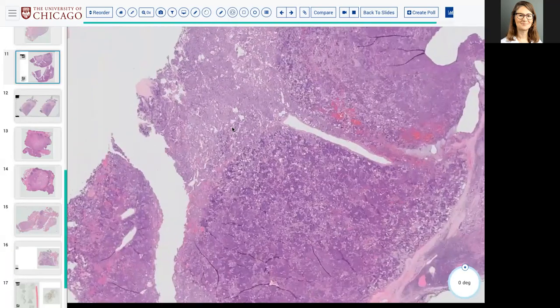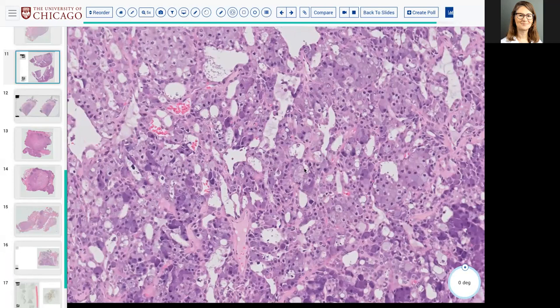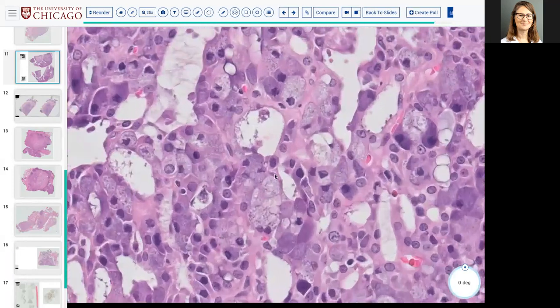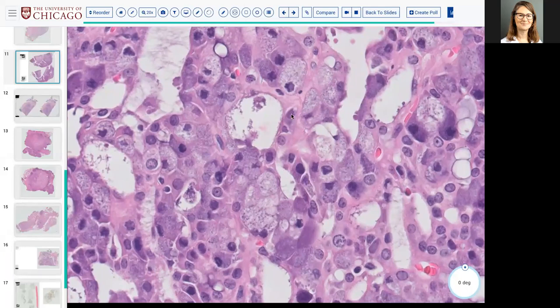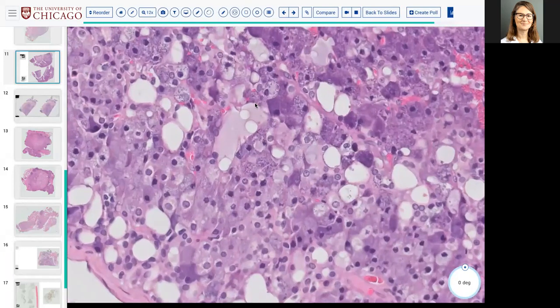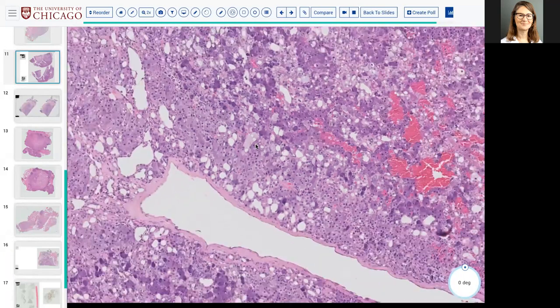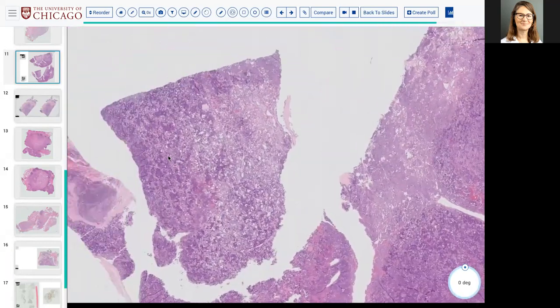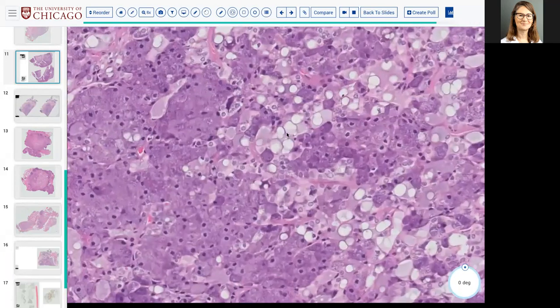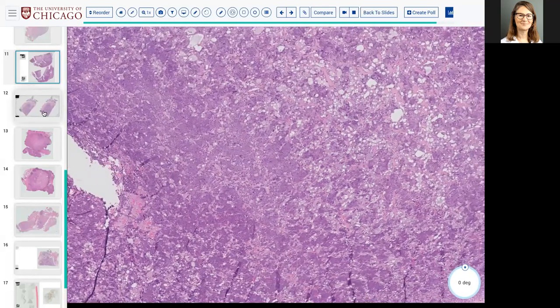What else is thought to be useful in acinic cell carcinoma? What other immunostain? DOG1. DOG1 can highlight the luminal border, sometimes also the cell membranous border of the cells. That can be helpful, but it's a little hard to interpret because it can be very weak at times. But if you see that luminal acinar highlighting with DOG1, that can be helpful. As with other monomorphic salivary tumors, these should be P40, P63 negative. If you're debating a secretory carcinoma, they should be S100 and mammaglobin negative, which would be a distinguishing factor.